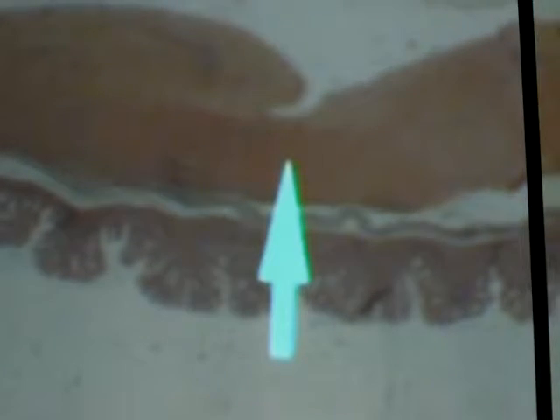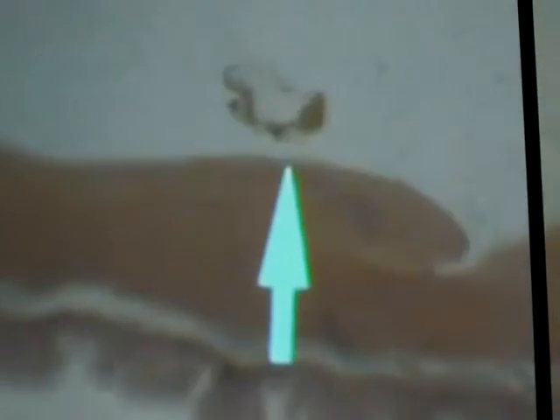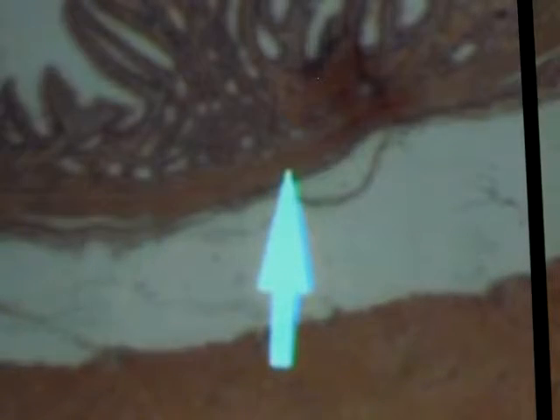Alright, so this is the scanning view of the junction between the stomach and the duodenum. Remember, you're pretty much looking for the change in the epithelium. You're moving from that flat appearance to this frilly appearance of the epithelium where you start seeing the villi projecting outwards. And we're also looking for the pyloric sphincter, where you have the thickening of that outer layer of muscle right at the junction.